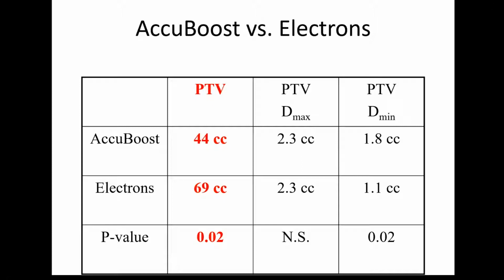Yes, a great question, and I'll show some of that data a little bit later in the presentation. And I agree, dose homogeneity matters, but when we look at small volume boosting techniques with brachytherapy, we're actually taking advantage of some dose inhomogeneity as part of the boosting procedure. I think AccuBoost has some advantages in that regard, and I'll get into that in a little bit more detail later in the talk.